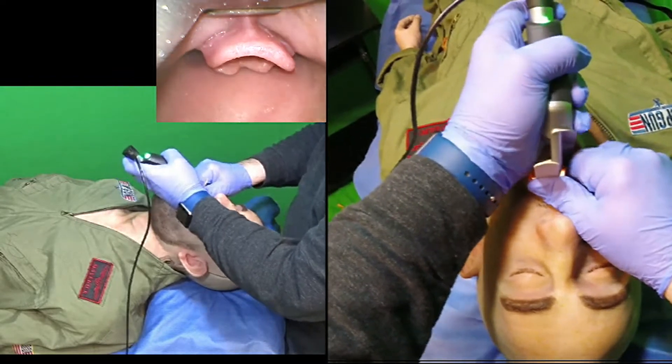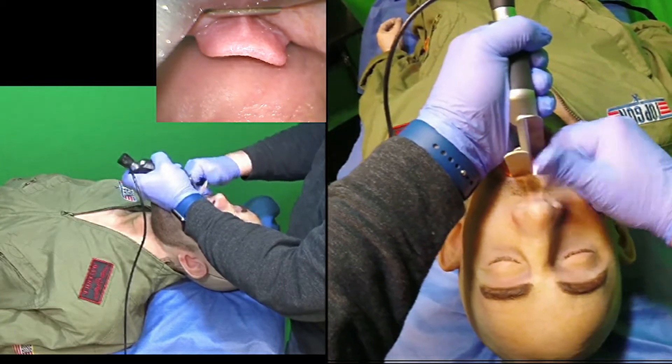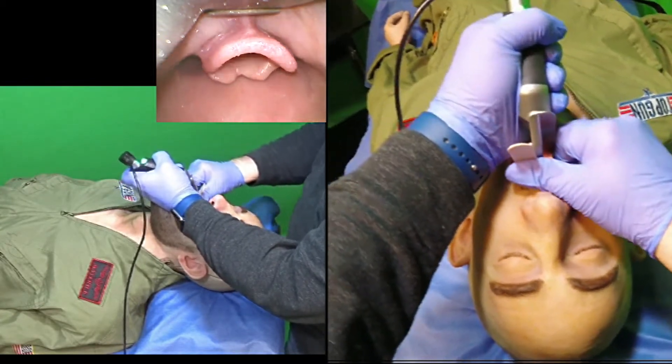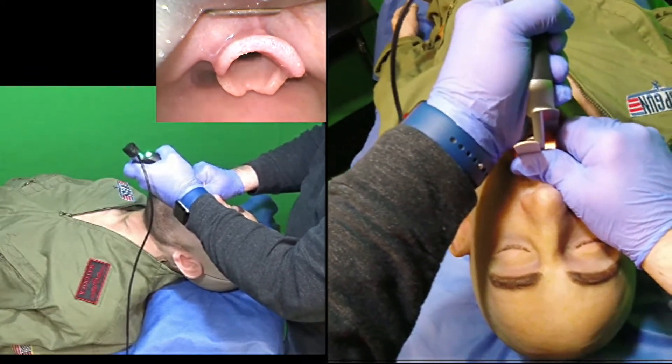I'm going to expose the larynx now. If I place my thumb against the underside of the blade, I can actually assist my lifting maneuver without levering on the teeth.